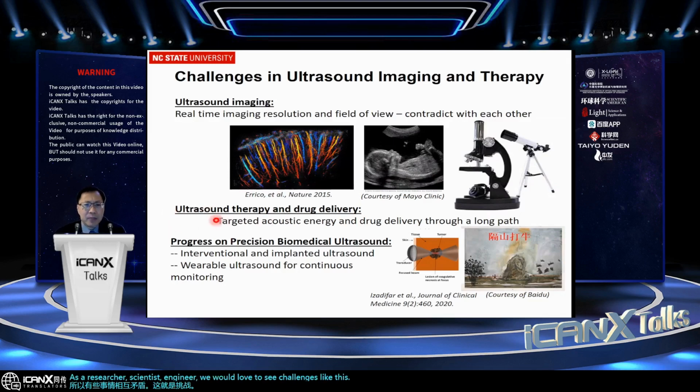If you come to ultrasound therapy or drug delivery, we really want targeted ultrasound. You want to target that acoustic energy to the region so that either drug delivery or treatment can be focused. And the good thing for ultrasound therapy, one thing is that it is non-invasive.